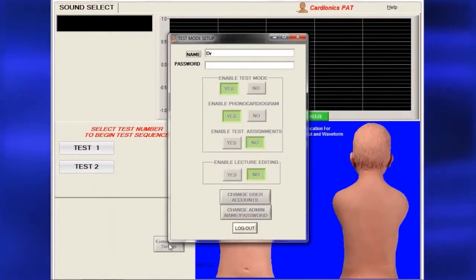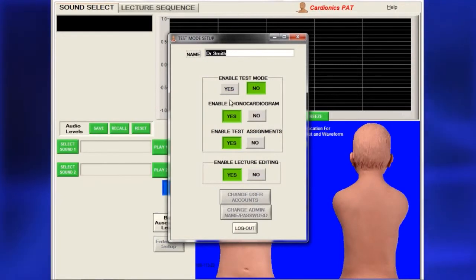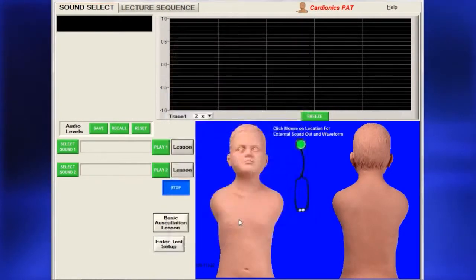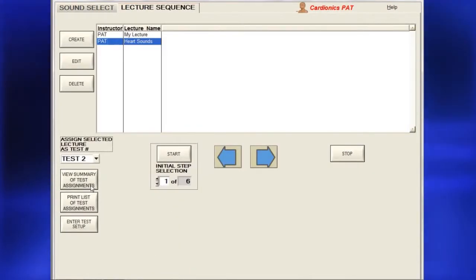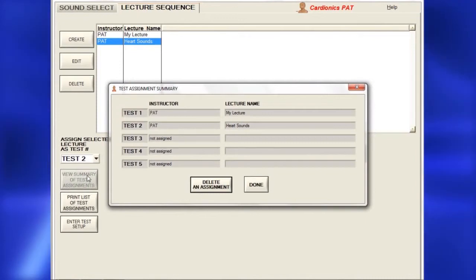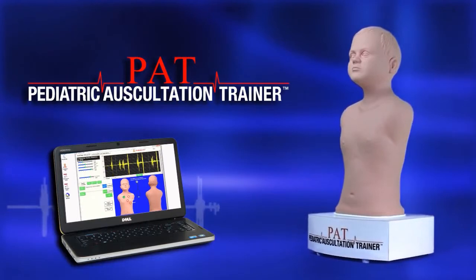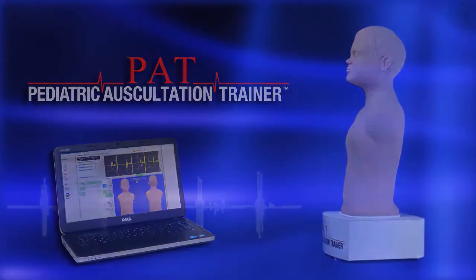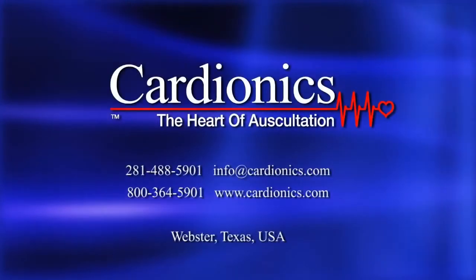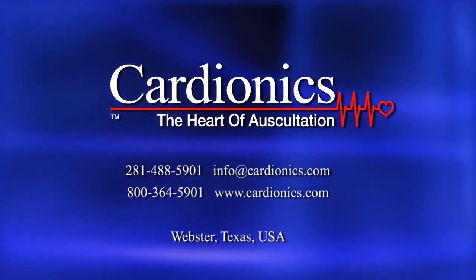When finished, you will still be in test mode, so you must return to the Test Setup page and enter your name to log out. To review test assignments, click View Summary of Test Assignments for the current list. This concludes the setup of PAT. If you have any further questions, contact Cardionics at 1-800-364-5901.